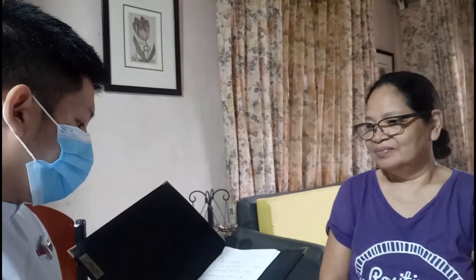Good morning po ma'am. Ulitin lang po natin yung information nyo. Kayo po si Ma'am Vivian Ramos, 63 years old female. For diagnostic knee x-ray for suspected arthritis po. Tama po ba? Opo. Ano pong nararamdaman nyo ma'am? Sumasakit yung tuhod ko, nahirapan akong lumakad. Sige po ma'am. Diretso na po tayo sa x-ray room.